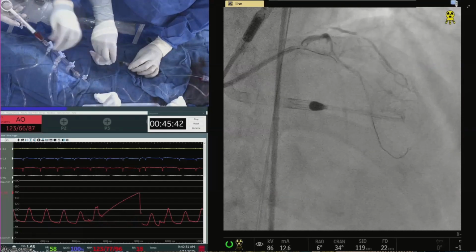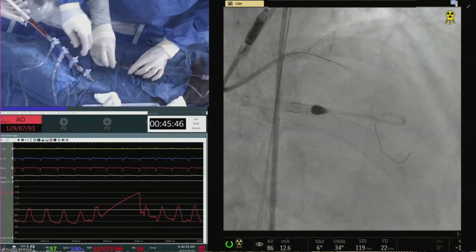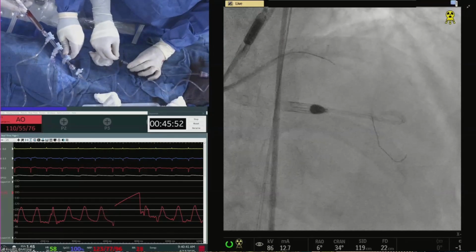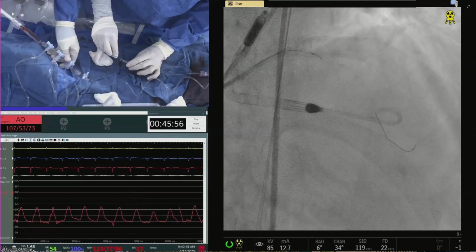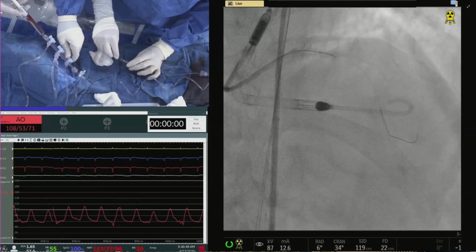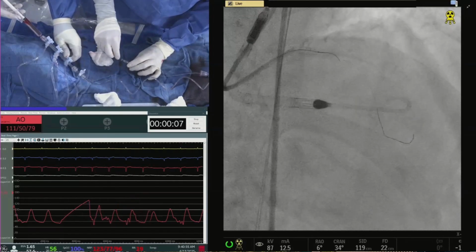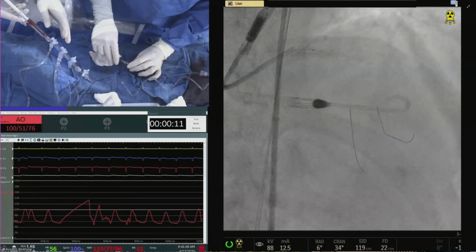Good, you definitely got more length on the bend. That's good. Yes. Now the Miracle may be able to do it, or the Gaia. Yeah. It's just not hooking. Okay. There it is. That's it.